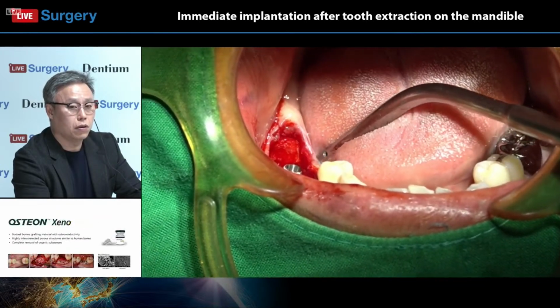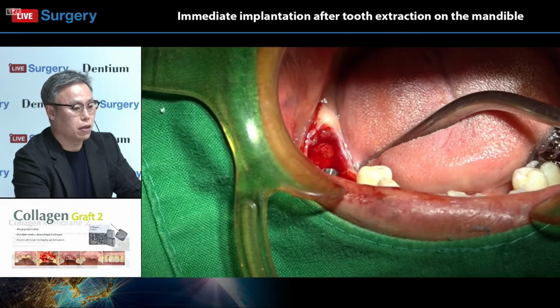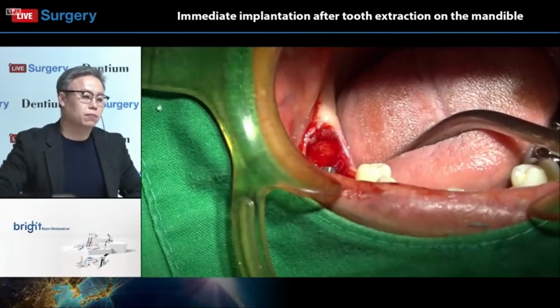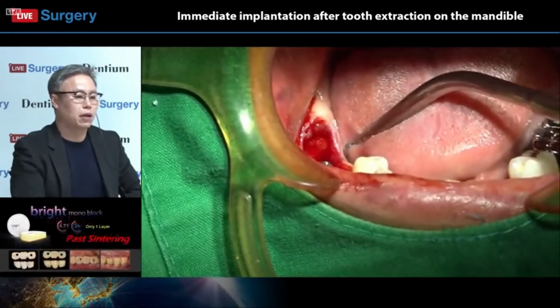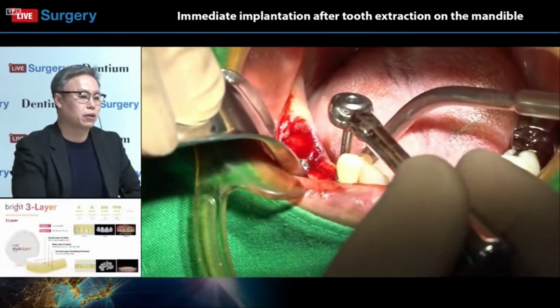So we always have to plan the bone graft simultaneously. Long time ago, there was some theory that for a gap defect less than a certain size, we don't have to fill the gap defect. However, nowadays, everybody fills the gap defect, even though it is a small defect.